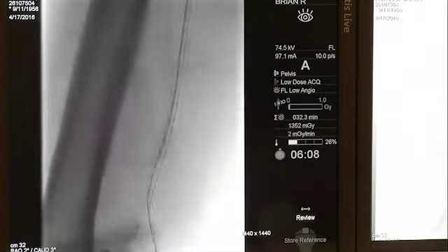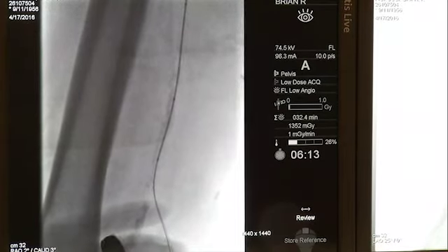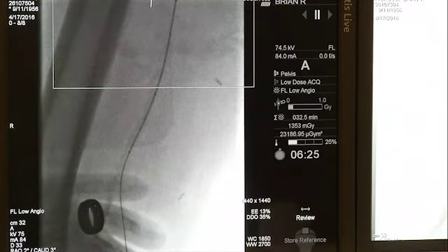Mr. Fiorucci, put your leg a little bit straight, my man. You're doing great. Okay, so we are now down to where we were. So now we can... let's go. Take this out. Take that sag out. Yeah, pull it up. Pull it up. Pull it up, yeah. So I'm just holding some pressure here in the meantime in his popliteal area.